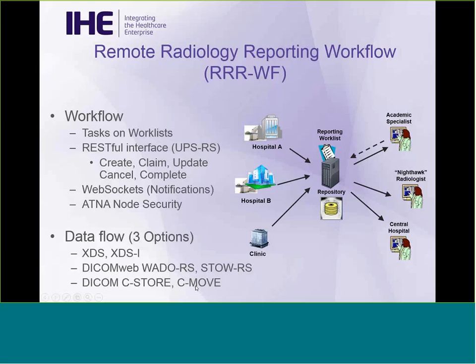And then there's your conventional, old-fashioned DICOM, which is used inside most hospitals. And in most cases, if you set up the appropriate network bridges, you can actually use these between hospitals as well, and a number of sites have done that. So there's the XDS option, the DICOMweb, and the DICOM option for how the data flows.